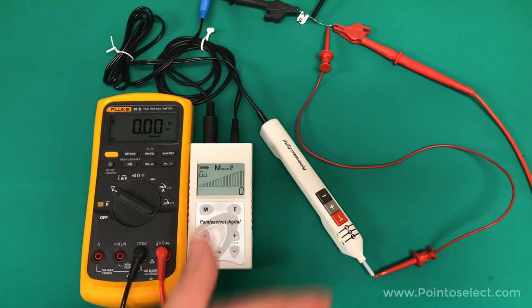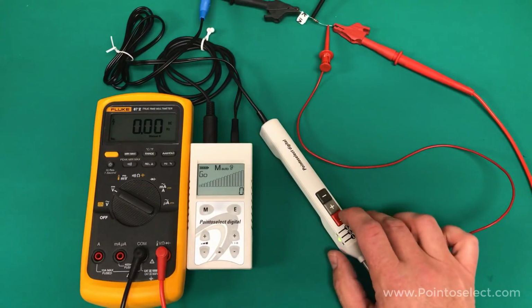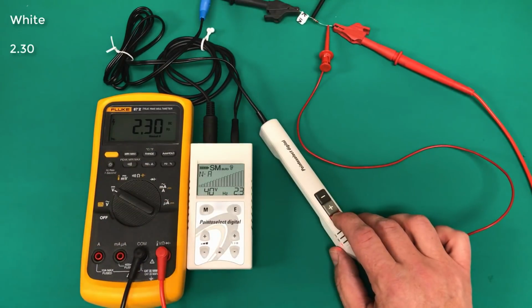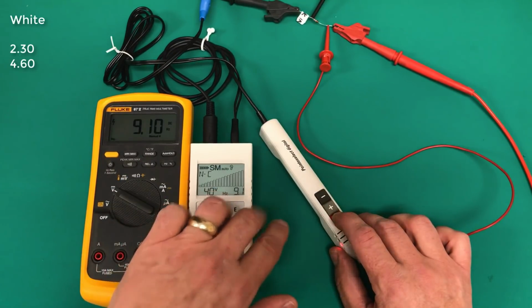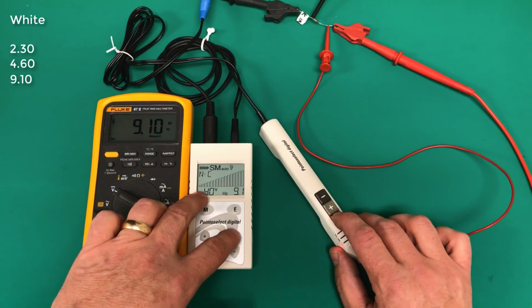And as you can see, we're getting good conductivity through the 1K. So let's go ahead and stimulate. All right, 2.3 gives us 2.30. Perfect. Right down to the hundredth of a hertz. 4.6, 4.60. Beautiful. 9.1, 9.10. Hundredth of a hertz. That is highly accurate.